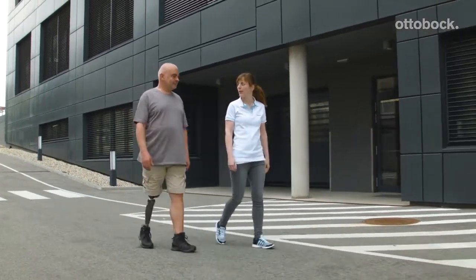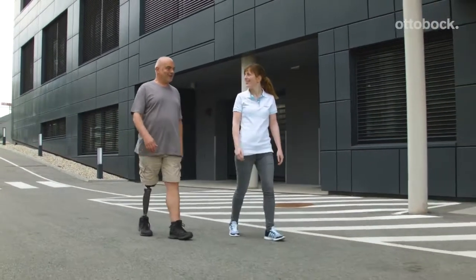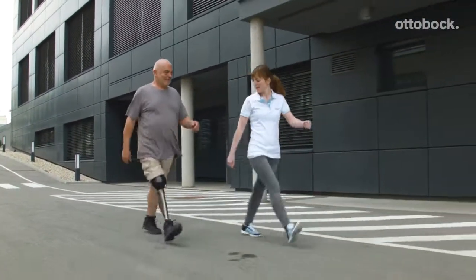Franziska and Gerhard train tempo changes, stopping with the prosthetic knee, tight turns and going backwards.